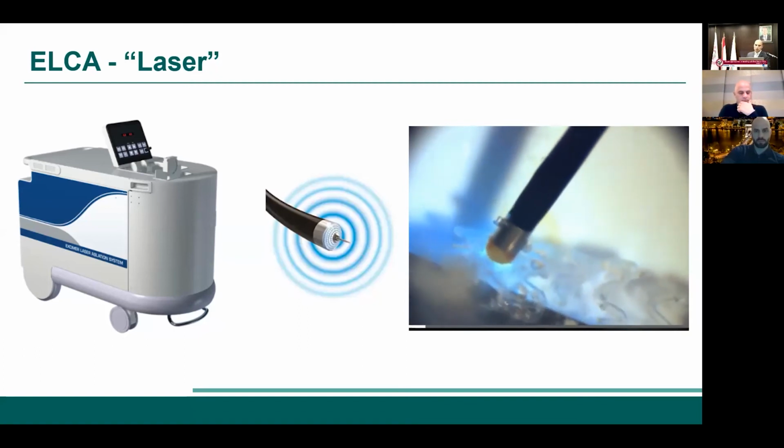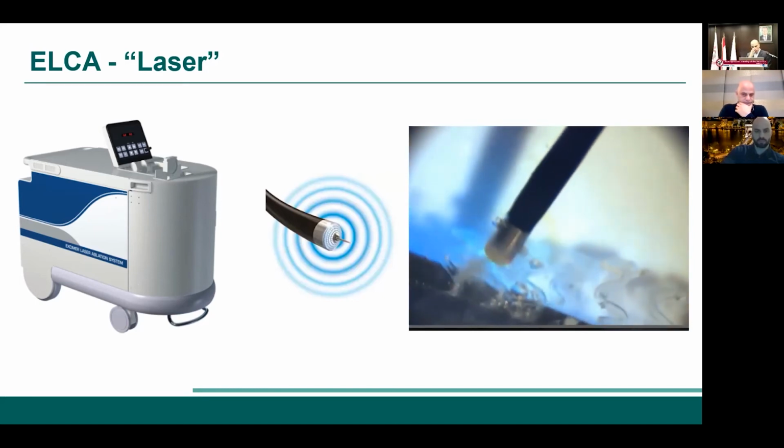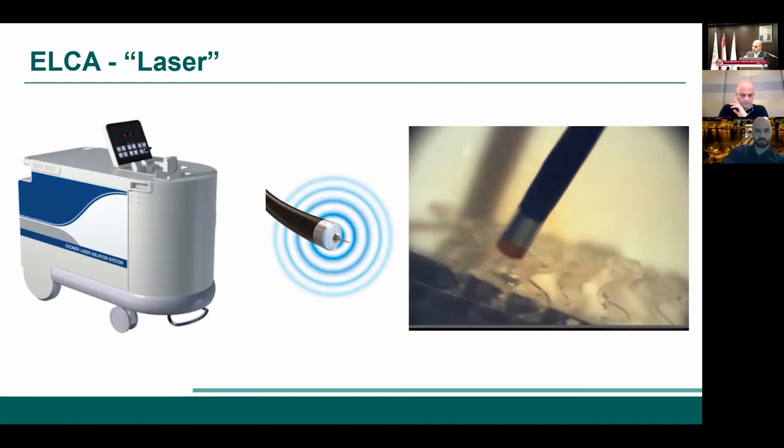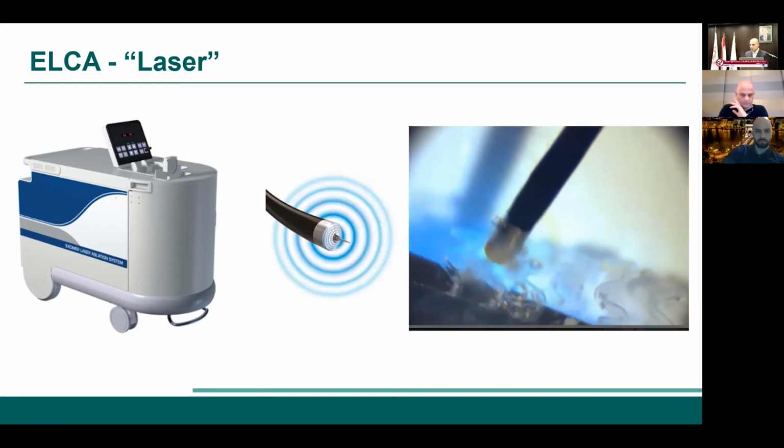But again, you saw how RotaPro is now smaller. The CSI comes on a pole. This is a huge and heavy device, still being used in some places. One thing to mention, I did not mention it: when you're doing it, you're flushing with saline. You have to have short runs and slow advancement, 1 millimeter per second almost. So all these things are not super welcome in the coronary space: flushing with saline, keeping this catheter for a long time.